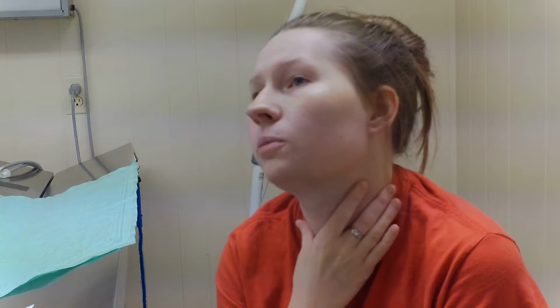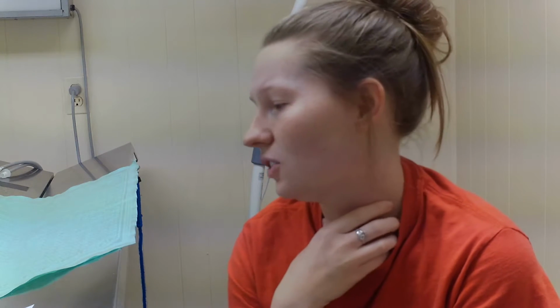The esophageal stethoscope really is an auditory monitoring device. Really, you're just kind of listening. You can either do that with an actual earpiece stethoscope attached to the esophageal probe that goes into the esophagus at the level of the heart, and listen to the heartbeat that way, or you can put it on an amplifier, which is what we have, and it's super old school. You heard it on the video. It sounds exactly like an amplifier, creating a lot of static, and it works when it wants to, to be honest.